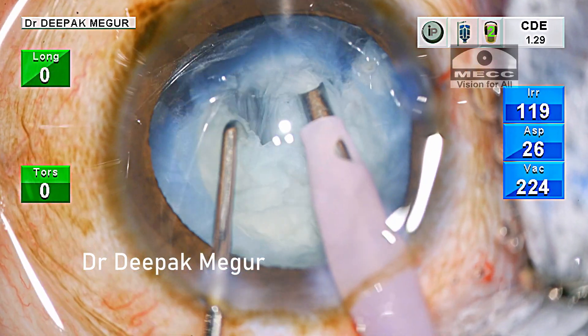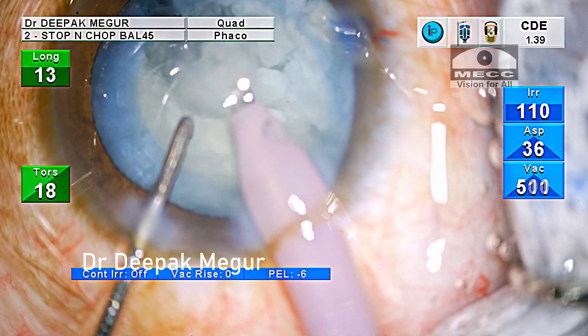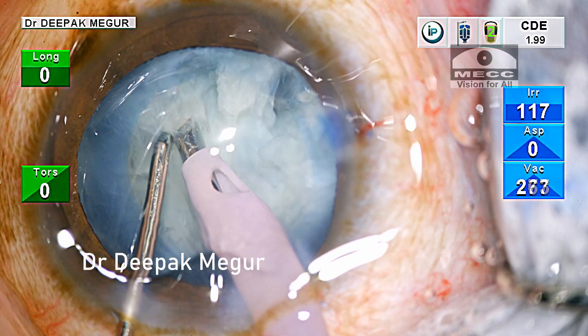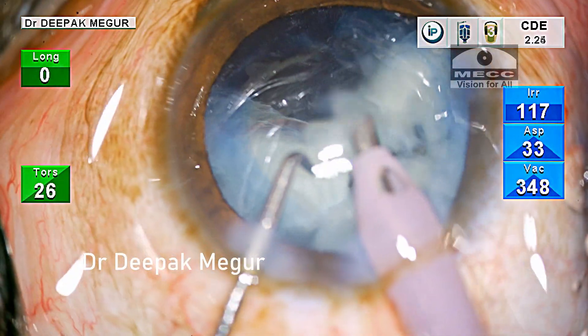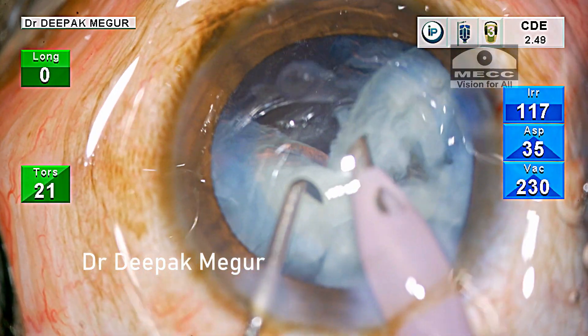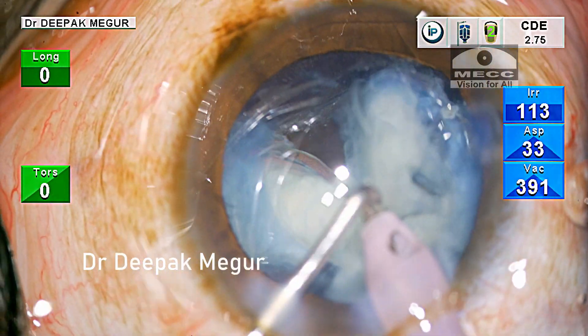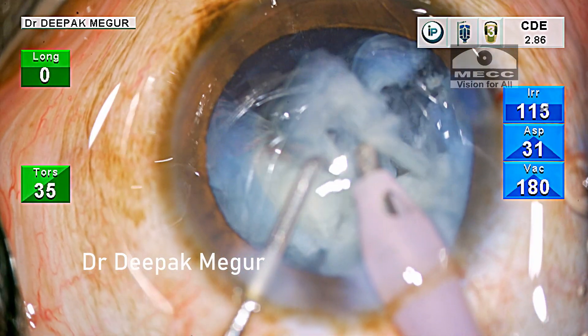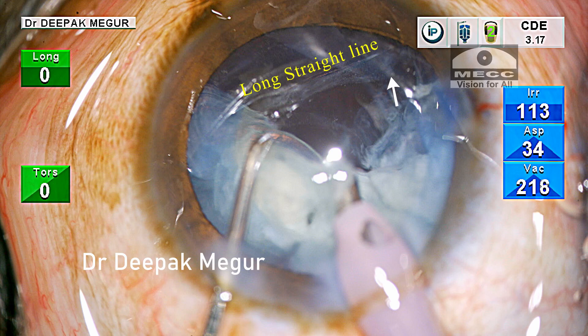After dividing the first heminucleus into smaller fragments, I emulsify the first fragment and then begin chopping at the second heminucleus. Until now I have not found anything unusual. As soon as I emulsify a large fragment, I notice this unusual long line posterior to the nucleus which is extending all the way up to the equator. Now this was suspicious.